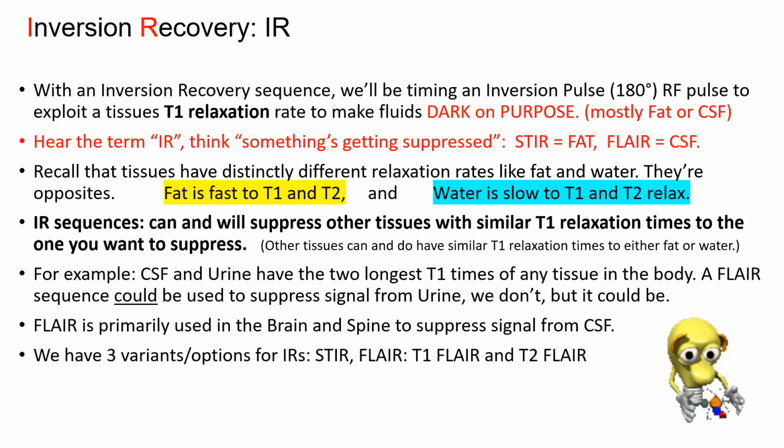It's not selective. Fat sat itself is very selective, and I'm going to go there in just a minute. So what are some examples of fast T1 tissue? Well, I said them the very first hour. Fat, GAD, and protein are fast T1 relaxing tissues. So if you do a STIR with a short T1, you're going to suppress fat, GAD, and protein.